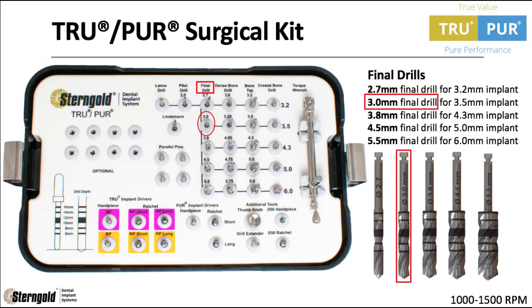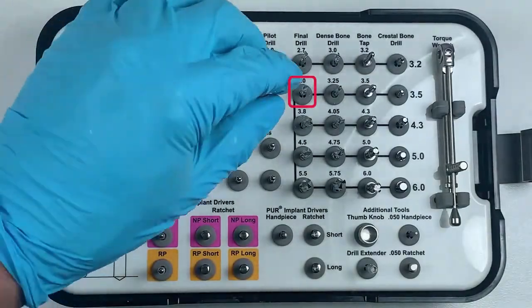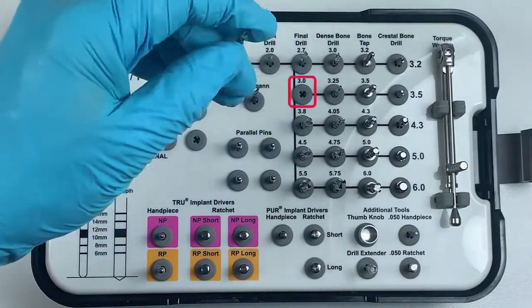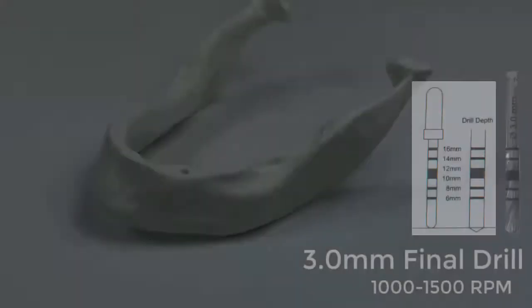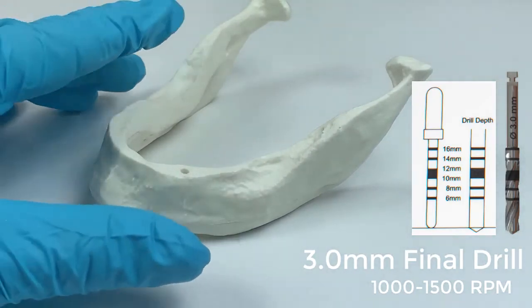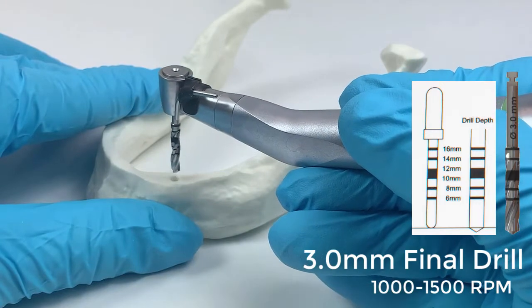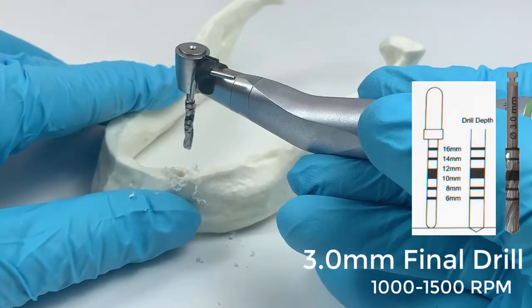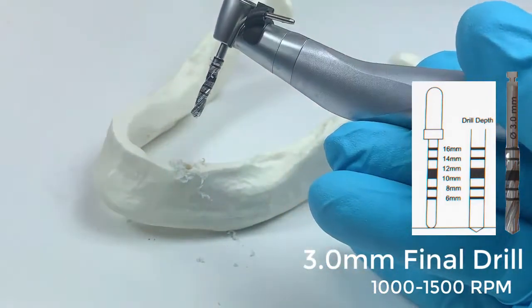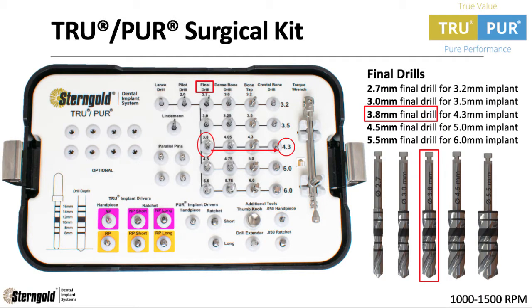Next, the 3.0mm final drill. The 3.8mm final drill is the last final drill for the 4.3mm dental implant.